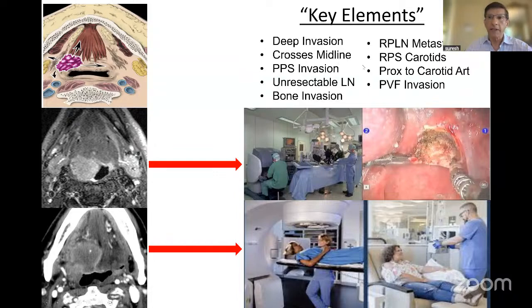Where radiology has really made a difference is that I don't necessarily believe in standardized reporting, but I do try to include what I refer to as key elements in my report. If I just say that there's a cancer involving the tongue base or the tonsil, well, I haven't really told the surgeons very much. Rather, when we get into a tumor board situation, what we want to do on imaging is identify specific imaging findings that are going to directly affect how these patients are treated.